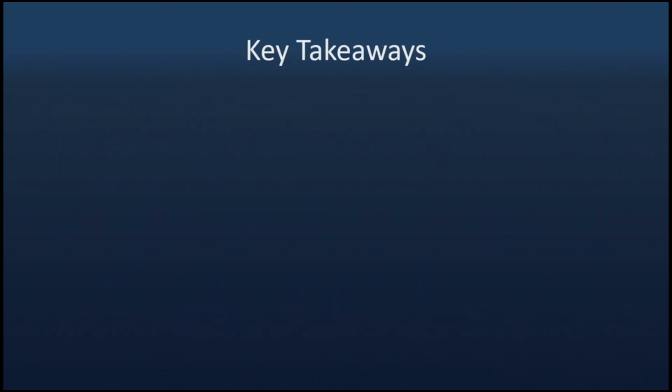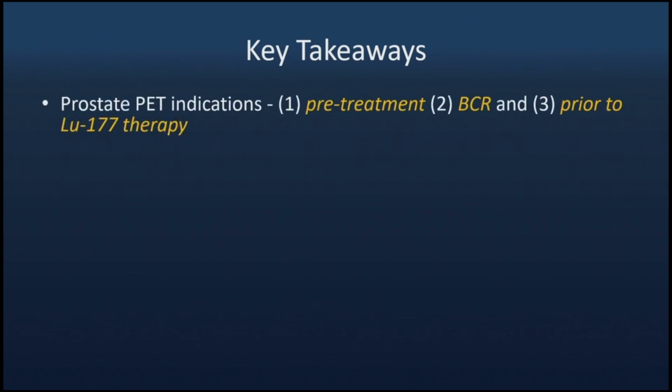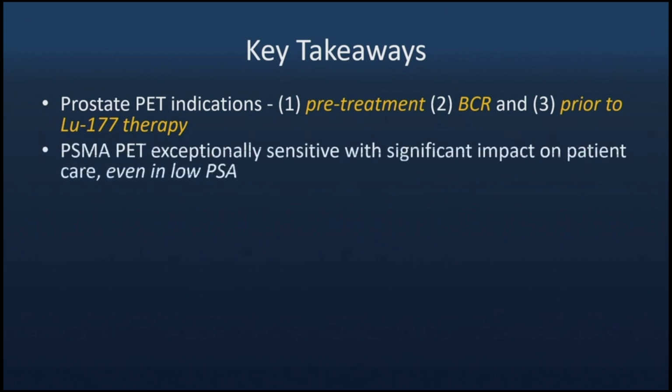So key takeaways here. PSMA PET, 3 primary indications: pre-treatment, biochemical recurrence, prior to therapy as screening. PSMA PET is exceptionally sensitive with significant impact on patients with even low PSA. We still haven't gotten that 0 bar, but the recommendation is about 0.2 for detection levels.